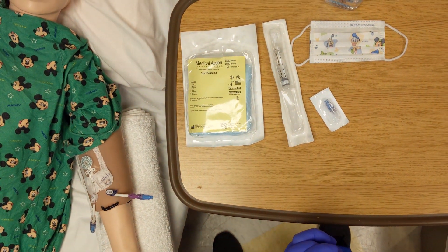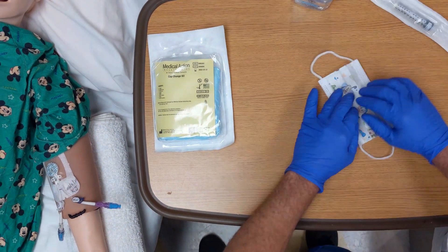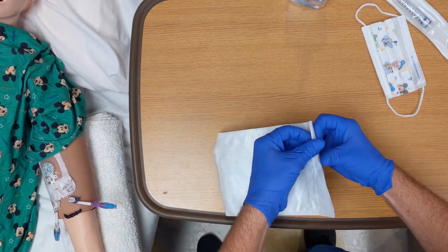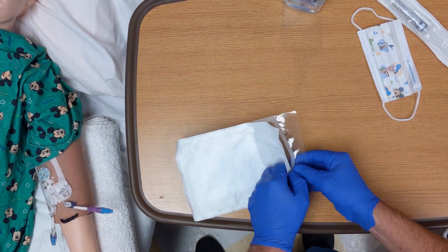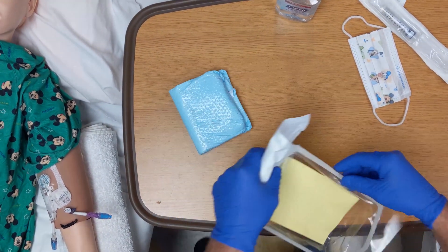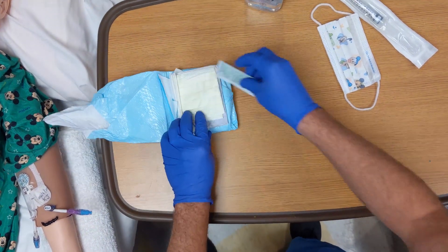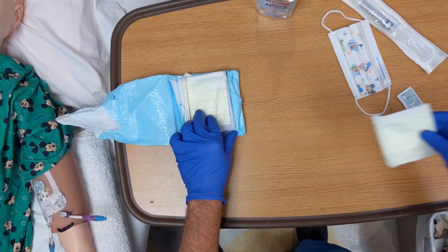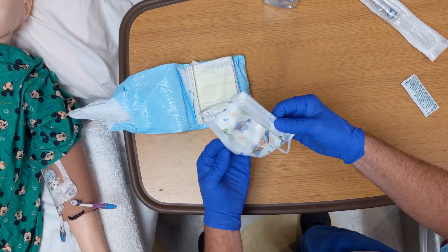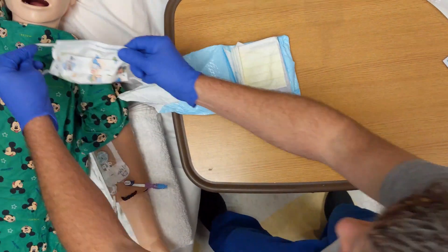Open your cap change kit and remove the masks. Place a mask on yourself, the patient, and anyone else within three feet of the patient.